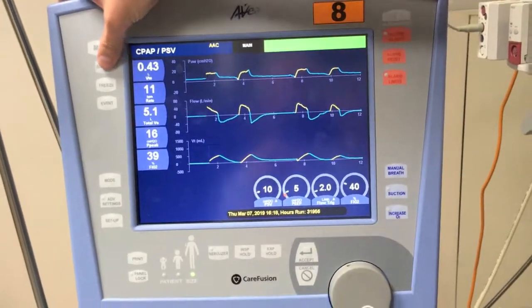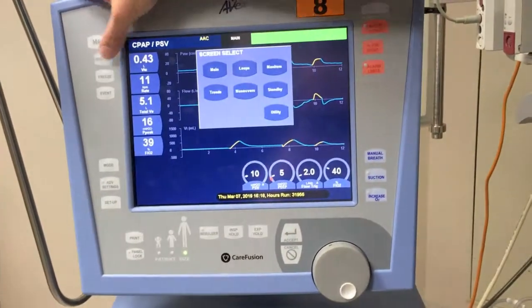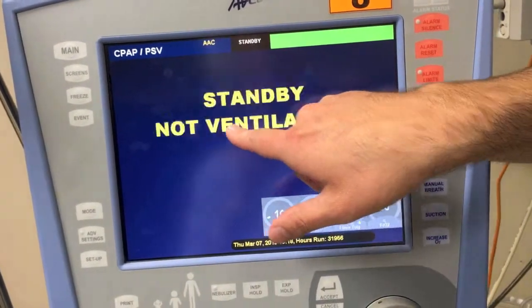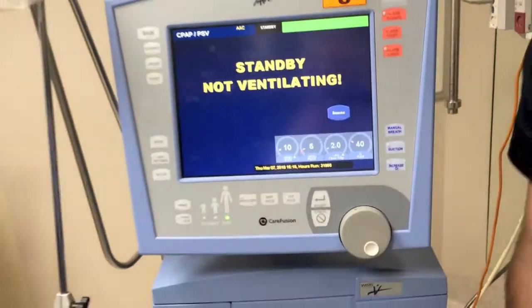I'm just going to turn it off now and show you how to do that. You go to screens and to standby. It will ask: are you sure you want to stop ventilating the patient? Yes. That's all I have to show you of the Via today.